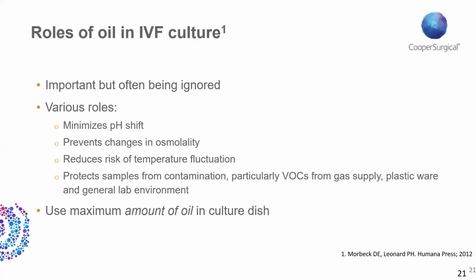And the mantra for embryologists should be, we use the maximum amount of oil in a culture dish without causing problems. So without overloading the dish so that you get the lid sticking or you get spillage. But our mantra should be, we use the maximum amount of oil in whatever culture dish we use, not the minimum. And where volume is restricted in some time-lapse cells, for example, then we might consider which type of oil we use, whether we use a lower density, lower viscosity oil or a higher one. In most general culture systems, volume is the most important factor, not the type of oil, although it may be protective in some circumstances.